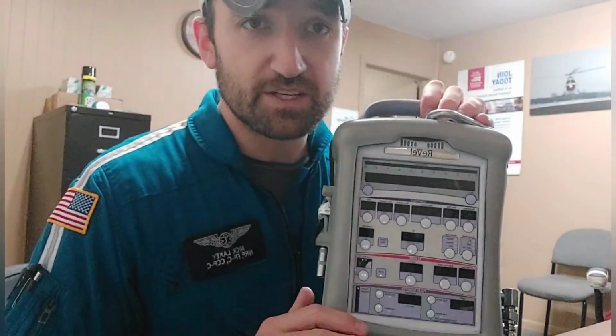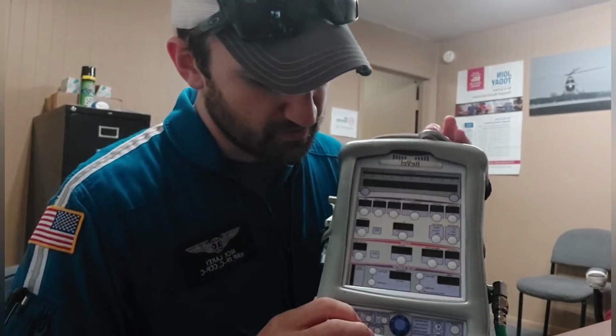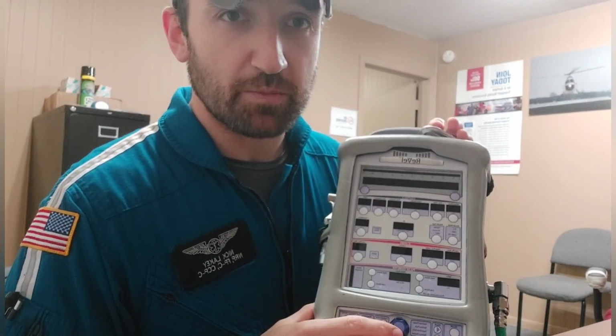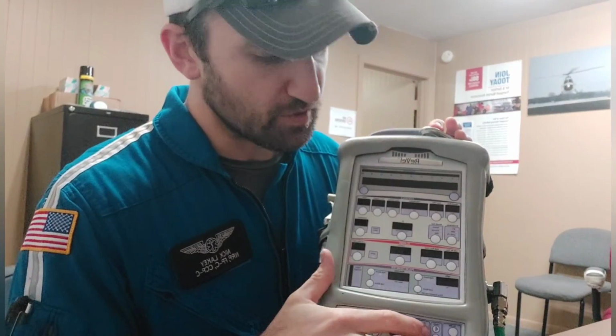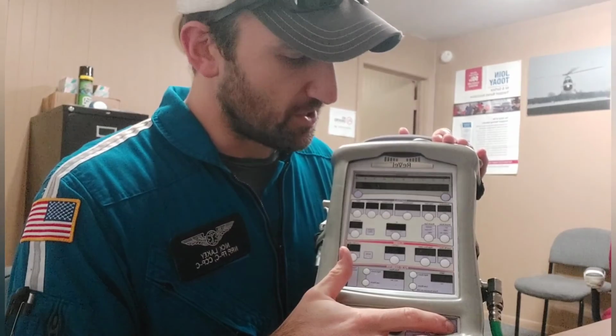So forgive me if any of this shows up inverted. I hope that it doesn't. It should switch things around, but it may show up slightly inverted, so please bear with me. The first thing that we would need to do is turn this ventilator on.